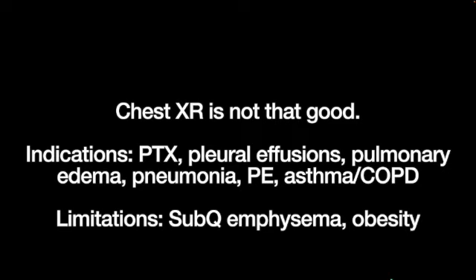Before COVID, I felt like we got a lot of two-view x-rays. And now, whenever I order a two-view x-ray, I get a call from the technician asking me if that's what I really need. Do I want that? Can they just do it at the bedside? And I understand they wanted to limit the spread of COVID, but one-view chest x-rays are just not that good. And that's where point-of-care ultrasound comes in.